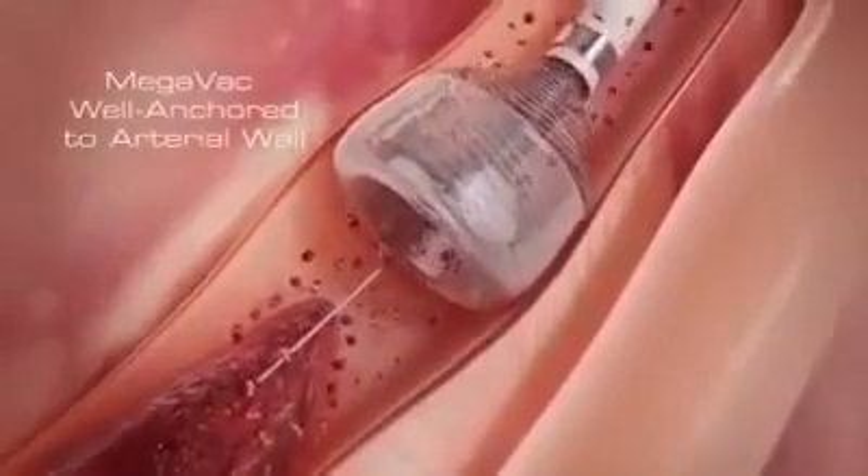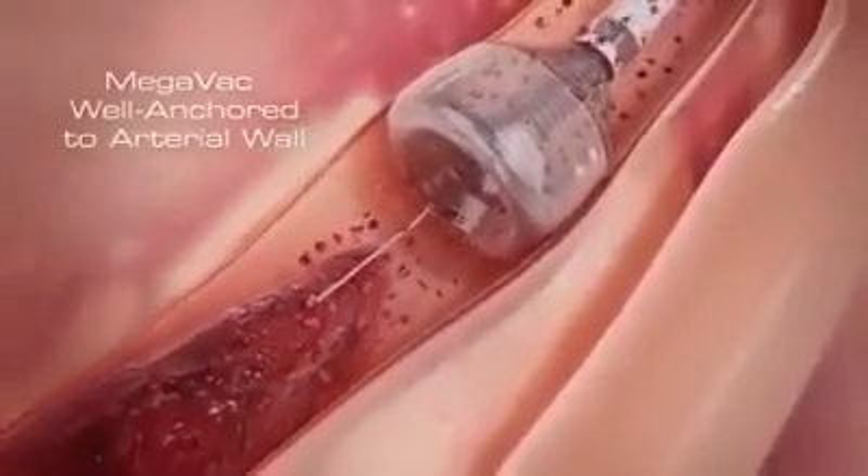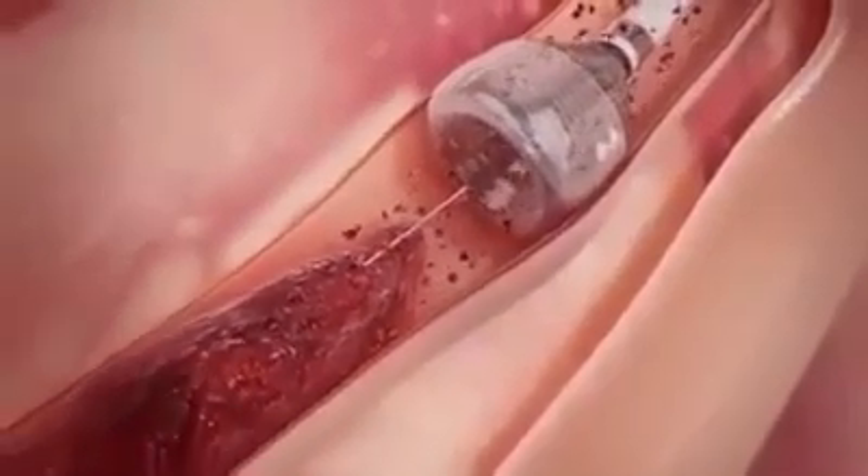The patient's blood pressure, along with the radial force of the funnel tip, combine to press the device against the arterial wall, anchoring the catheter firmly and safely. The outward expansion of the MegaVac anchors and centers the device, and can be used as an anchor for other devices when crossing tight lesions or tortuous vessels.